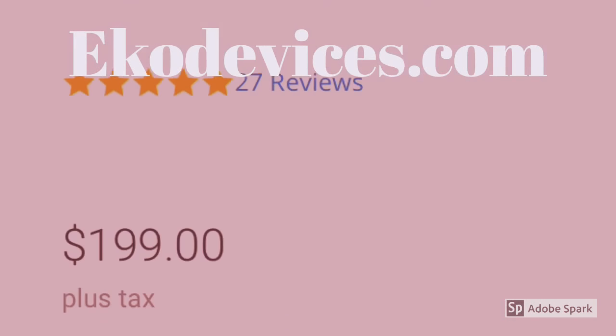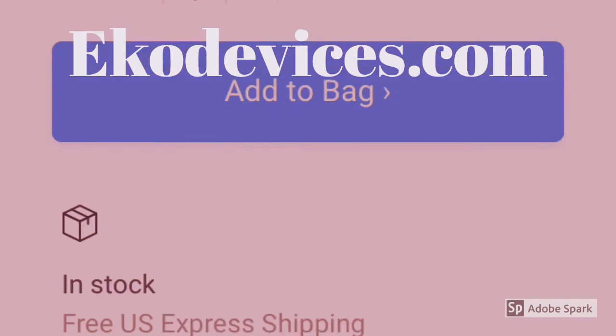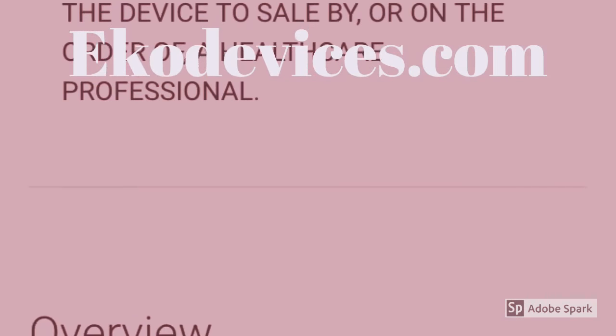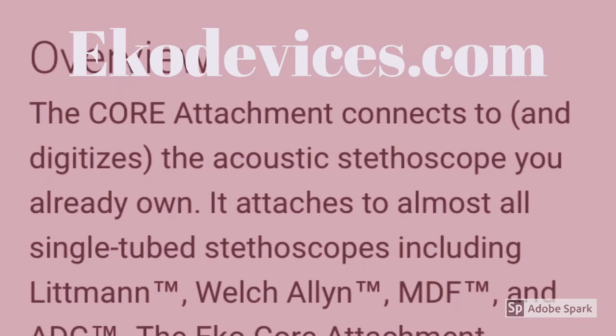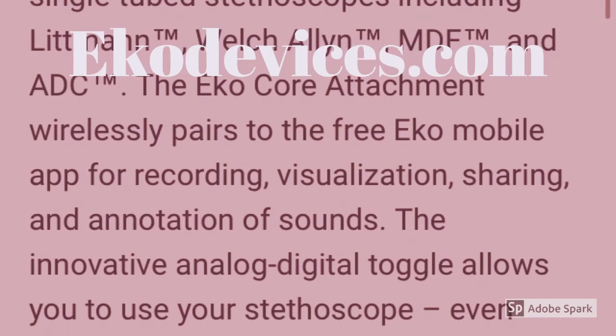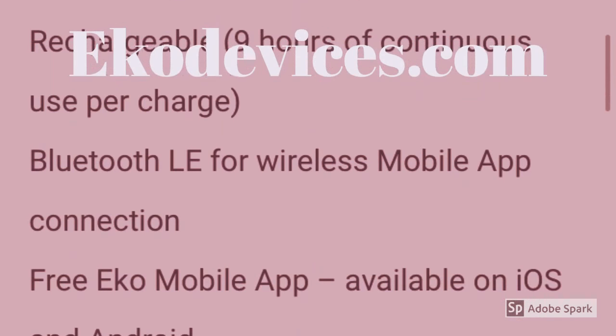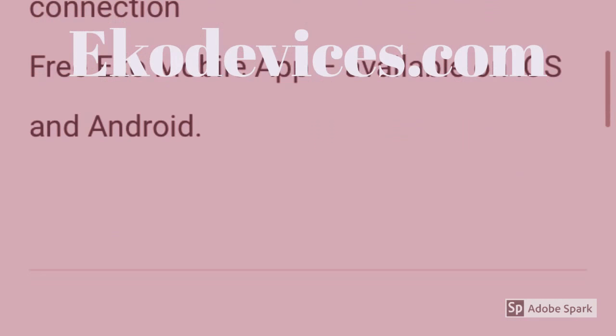This is Ekodevices.com, the manufacturer's website, and I'm just taking a look at what it says here. Looks like I have a year warranty and it attaches to a number of stethoscopes. There is an app that works in both iPhone and Android. It has amplification, it's rechargeable, and I can still use my stethoscope in analog mode if I don't want to turn the electronic part on.